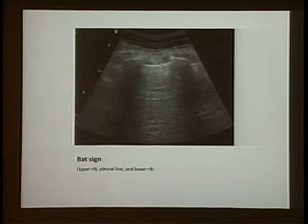And this is what I was telling you about. You put your probe longitudinal way, marker towards the head. And then you're going to get things like this. This dark region here is your rib. There's no echo imaging because the rib is blocking the ultrasound.